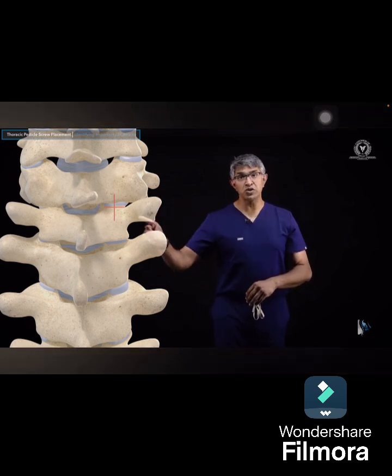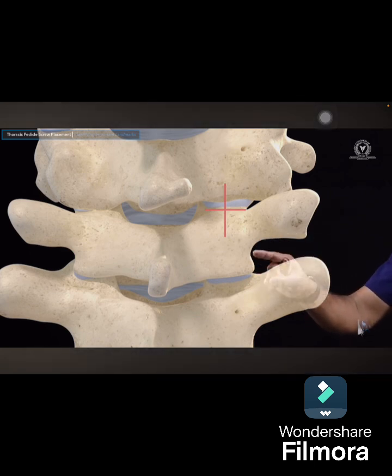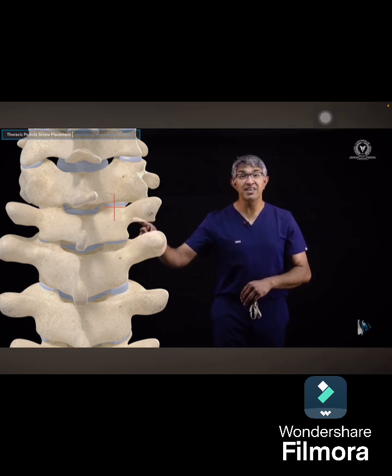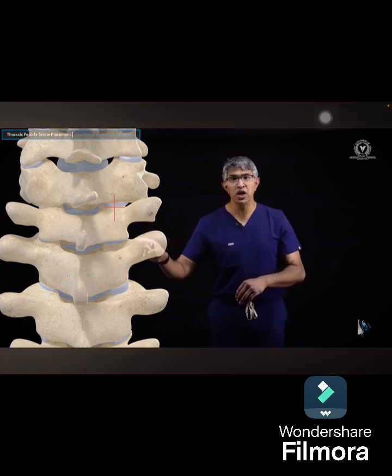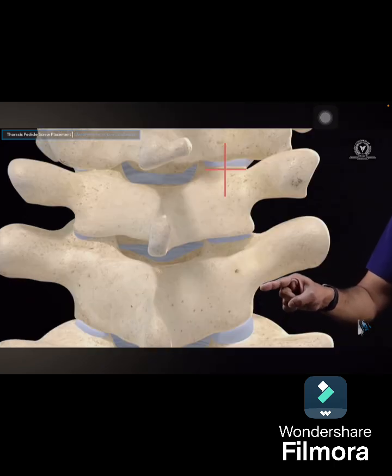The other way of doing it is to look at this structure here. So this is the transverse process there. Here you can find the pars. You can see me just outlining the pars right there of T1. And it's important when you're trying to put a pedicle screw in here to look at the pars of the same level. So for example, if you're doing it at T2, you're not looking at this pars up here of T1, you're looking at the pars of T2 over here where it meets the TP. This is the pars of T2 over here and extrapolating it up.